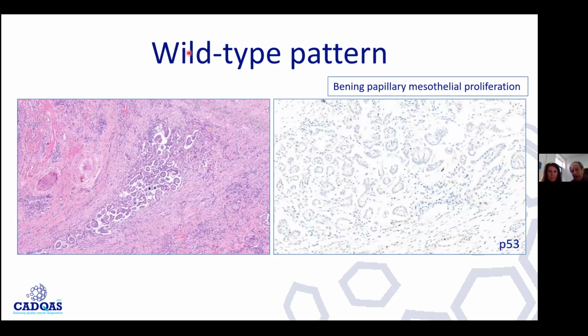But what you're showing now is that, just to preempt your presentation a little bit, one of the mutated patterns is complete absence of staining. Yeah. And then the interpretation: you see here a few staining nuclei, which means the protein is there wherever it is needed, rather than being completely absent. Absence of staining has a completely different meaning. And in this situation, it's good to understand that there is staining in the tissue, because if the tumor cells, so-called, were all negative, then we need to have an internal control. But we'll talk about this a bit later.